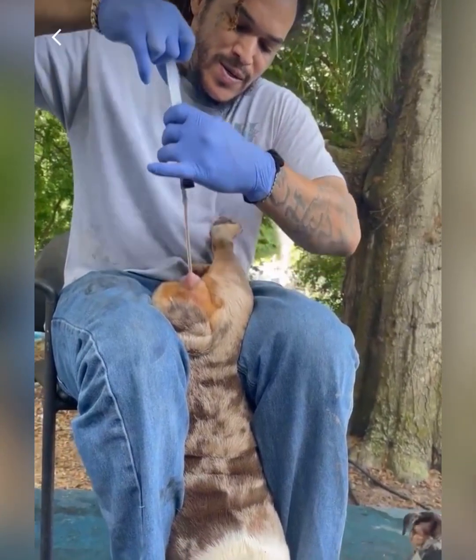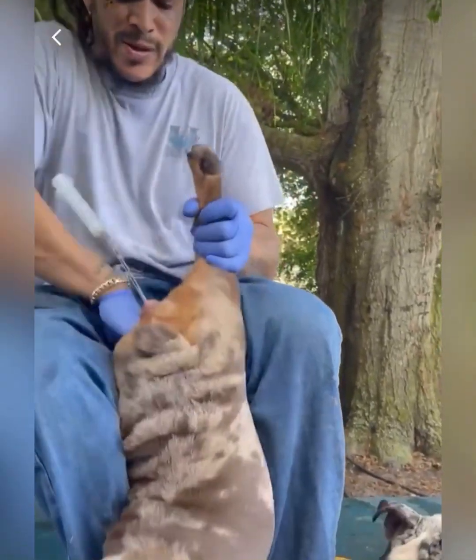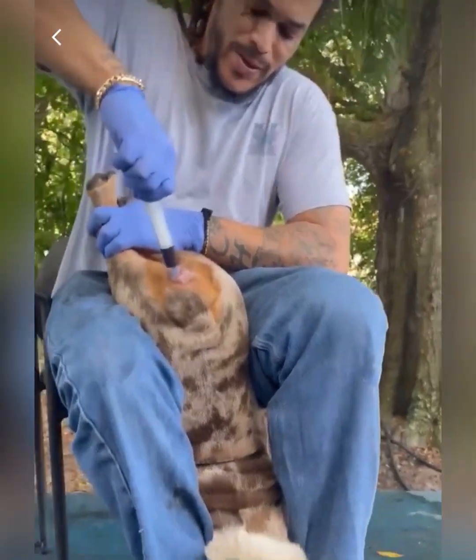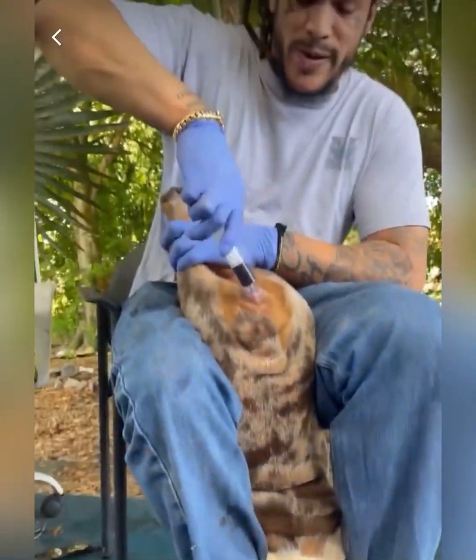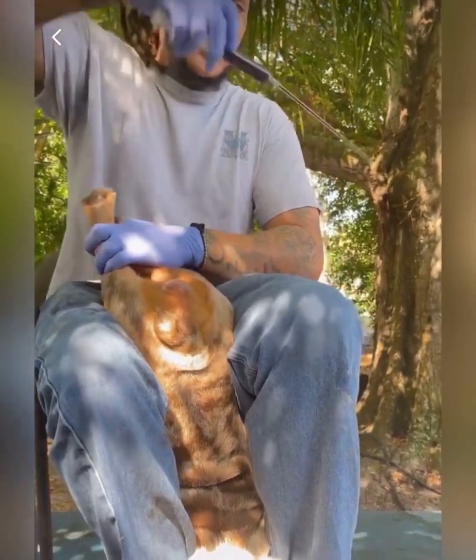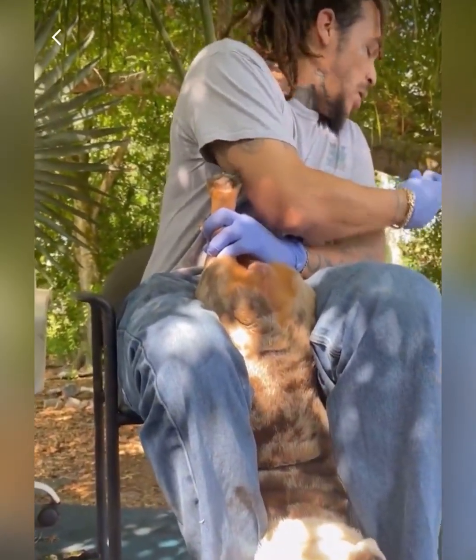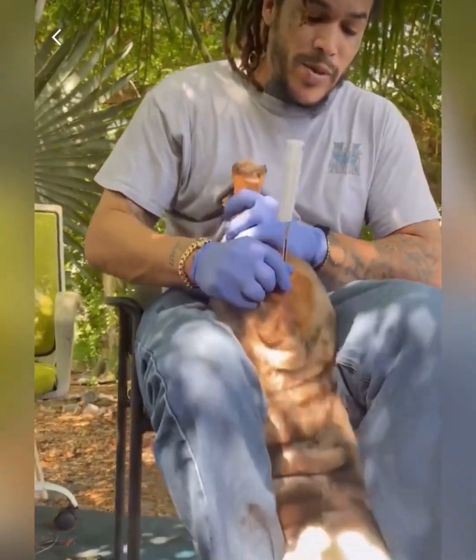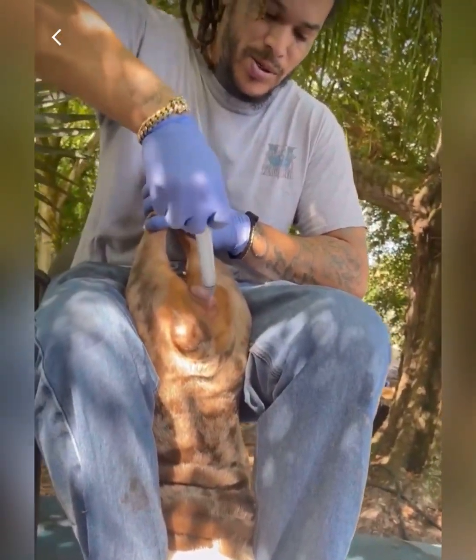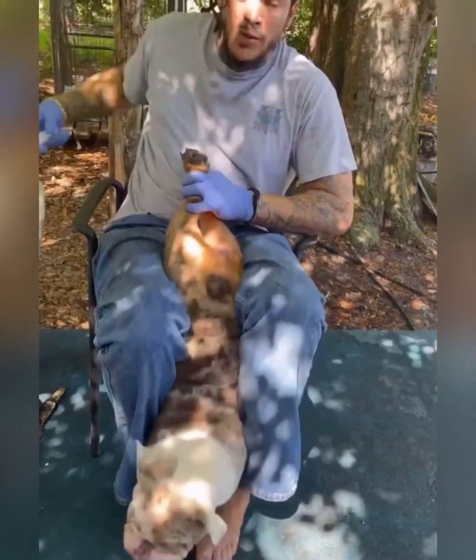So I'm gonna take this stuff out and flush her uterus. Look at this — and mind you, this is a 24ml syringe, so I've already pulled out three or four of these. You see this? This is disgusting. It's hard to be in the breeding business, you know what I mean.